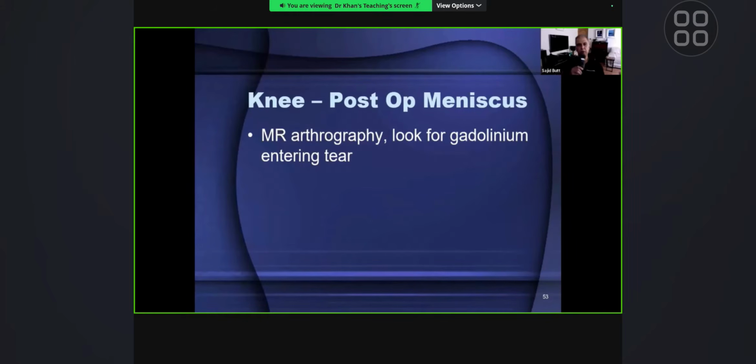People have tried doing MR arthrography, both direct and indirect. Direct arthrography means you inject gadolinium in the knee joint space and then see the little clefts which get outlined by gadolinium, which indicate the presence of a meniscal tear. Or you can use intravenous gadolinium and then image to see if there is any enhancing scar tissue or granulation tissue in the meniscus. But unless you have the previous imaging, it is quite difficult to know the full significance of these.